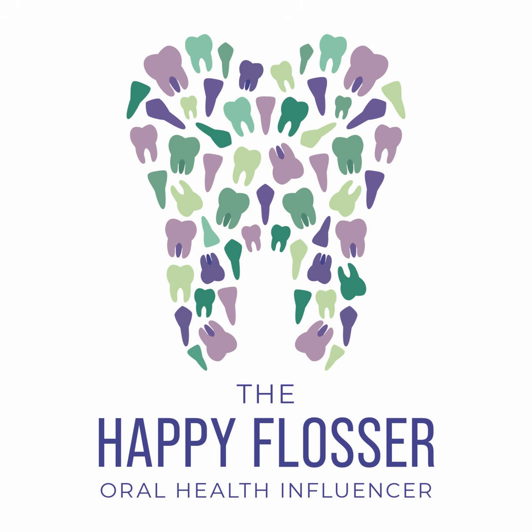In the posterior region, the anterior film is centered on the premolars so that you're able to capture the distal of the canine posteriorly. The posterior film is centered so that you capture the distal of the second premolar and posterior.